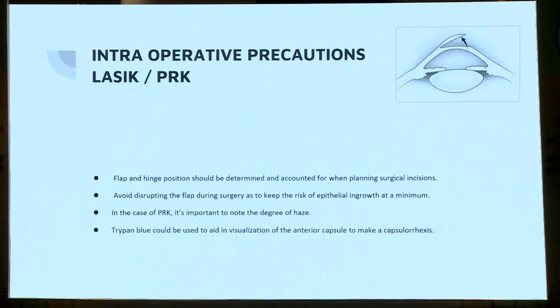Intraoperative precautions in patients with LASIK or PRK. In LASIK patients, it is very important to determine the LASIK flap and hinge position, and do not disturb the flap position during the surgery, so that you do not get any epithelial ingrowth.